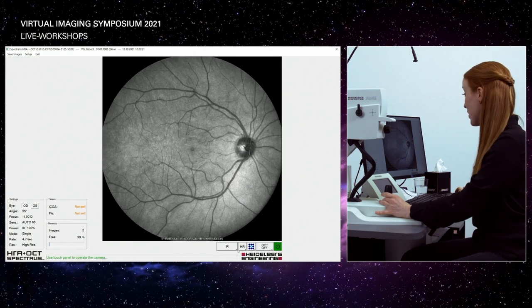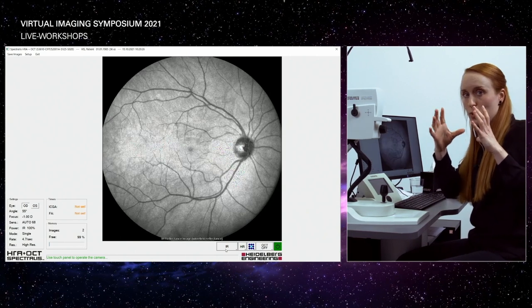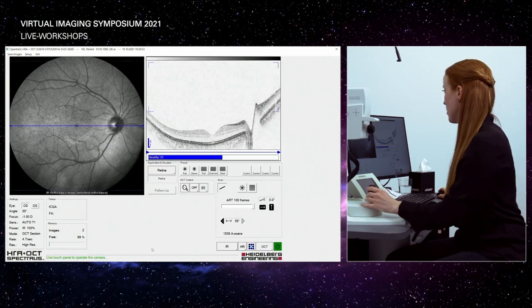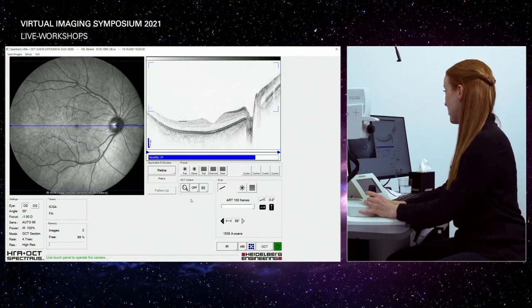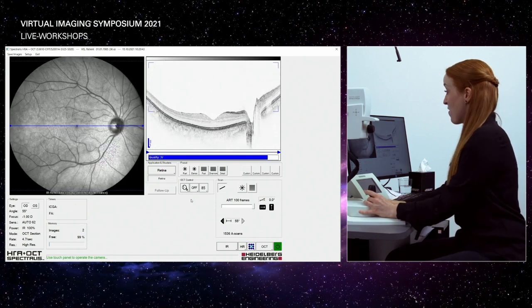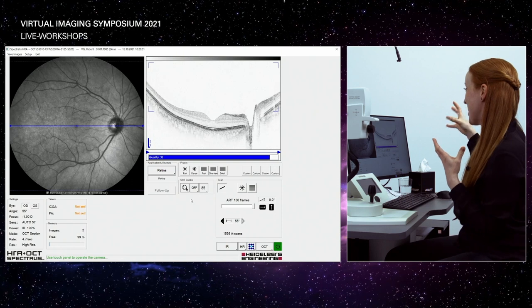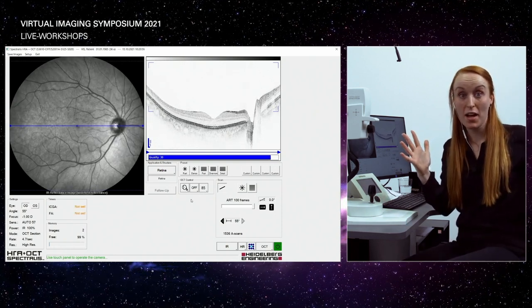And of course, you are able to combine this 55 degree field of view with OCT as well, and this is what I'm going to show you now. You can just activate this OCT right here and get everything into focus. What you can see is that the spherical shape of our eyeball, that's why it's called eyeball, gets more visible here in this greater scan size, okay?